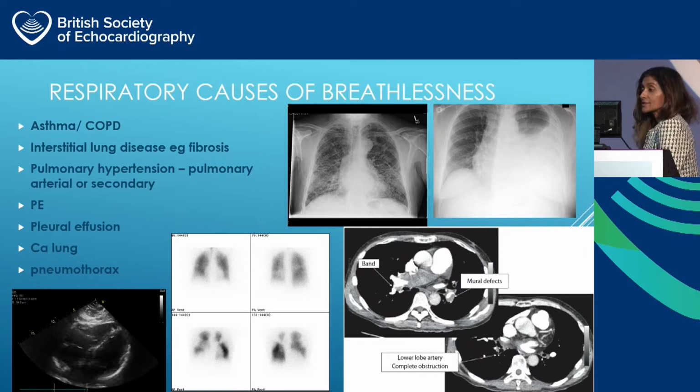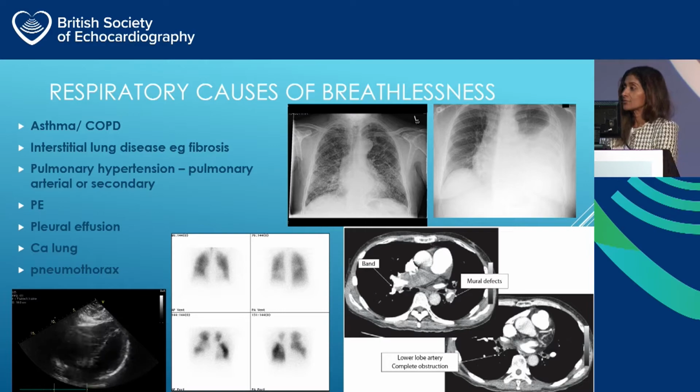The one on the right is a pleural effusion, I'm sure you can see that, and the lower pictures, the VQ scan in the middle shows lovely ventilation, smooth outline of the lungs in the top two images, and this patchy defects of perfusion.